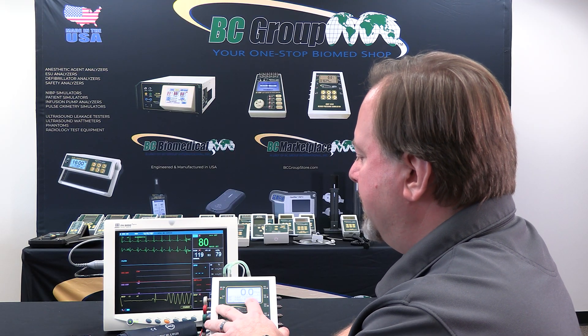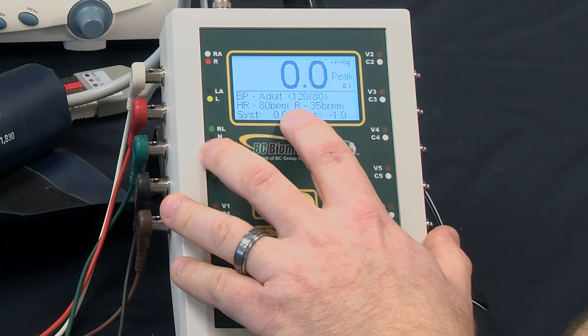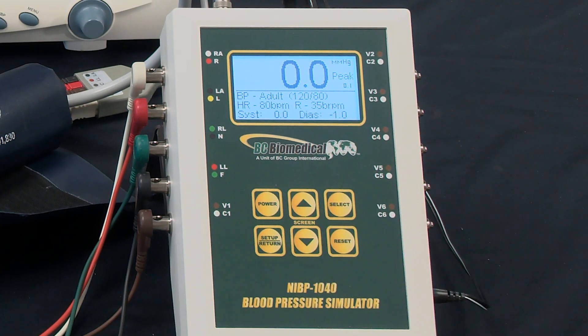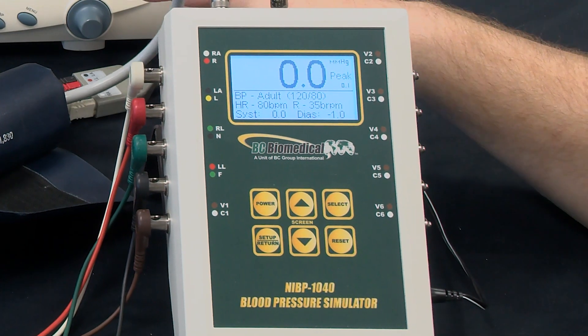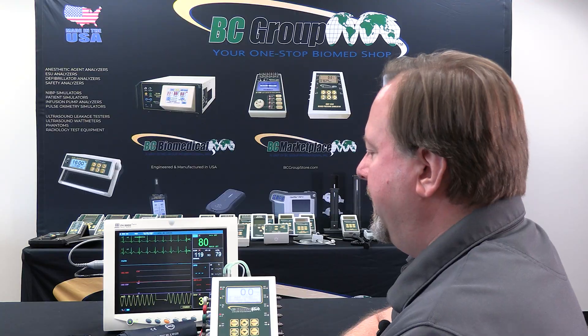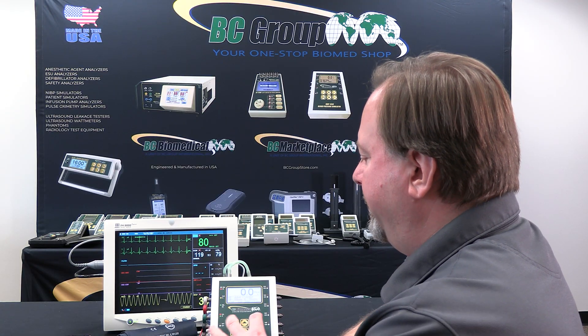Respiration is designated by the R and it's showing 35 breaths per minute. It takes a few seconds for the monitor to measure that data, analyze it, and provide a respiration measurement. And now we get our 35 breaths per minute.